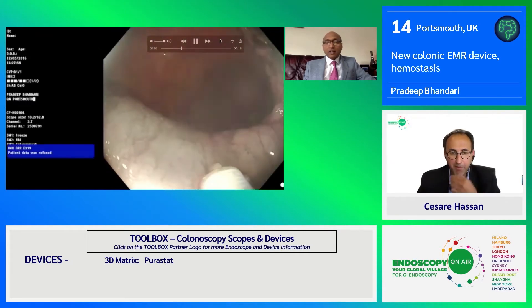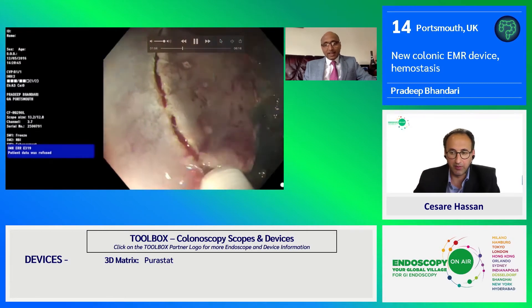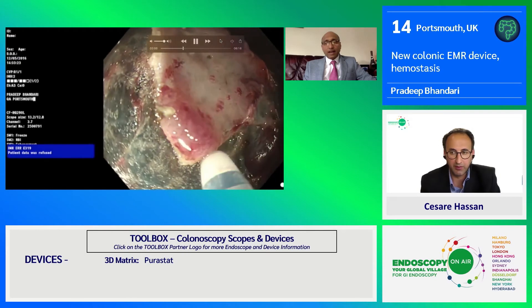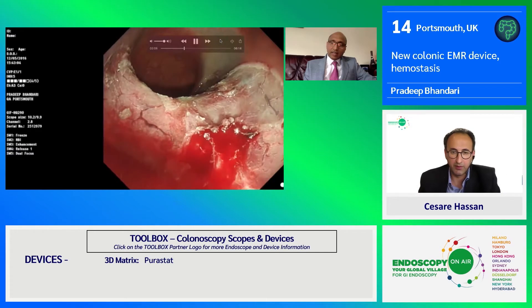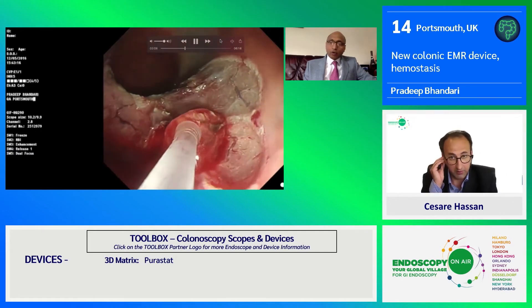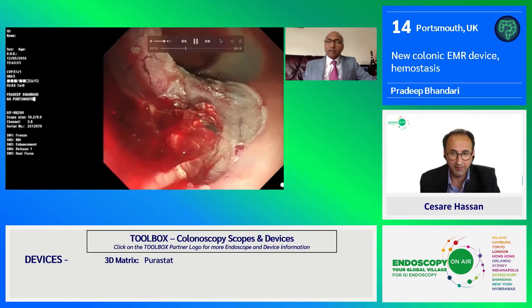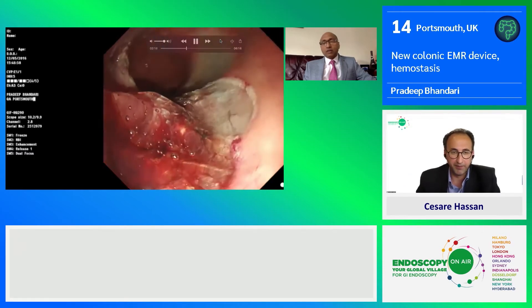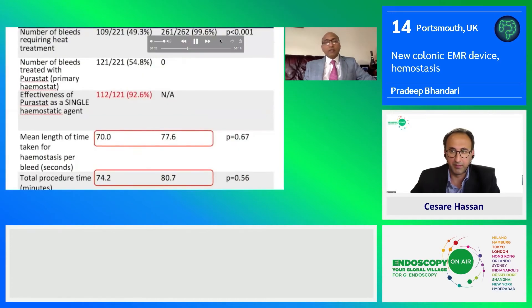Another example — a scarred lesion in a colitic bowel. These are very high-risk, very difficult lesions to resect, and people should generally not interfere with them. Anyway, we resected it by ESD and right at the end we had a big bleed. In the colon, using a coagulation grasper on a bare muscle base can be very dangerous, so we preferred using PuraStat. You can see in real time the bleeding has stopped — the gel is transparent and there is no bleeding.